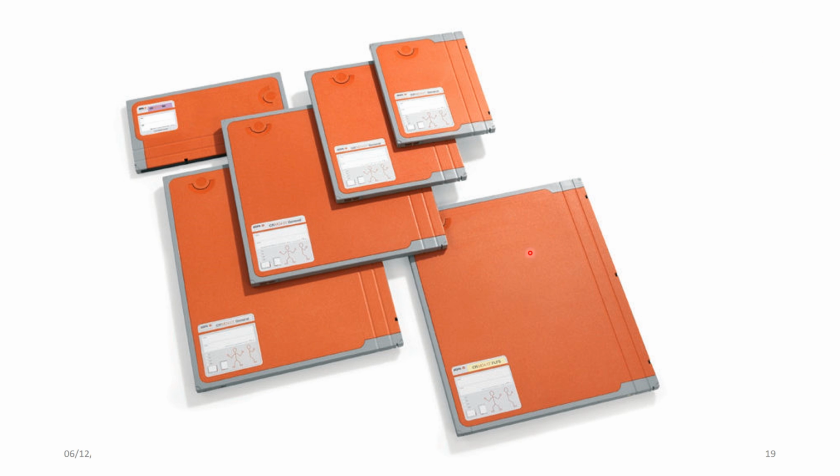That's what the normal X-ray cassettes look like. It's pretty much a standard. I don't know about the United States, but AGFA are pretty popular, and these cassettes are very popular. I've been in two or three X-ray departments that have only ever used AGFA, and the other one was Philips. And they look very, very similar, although it was just purple rather than orange.